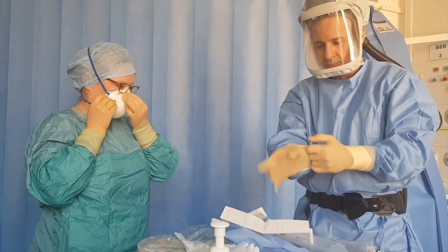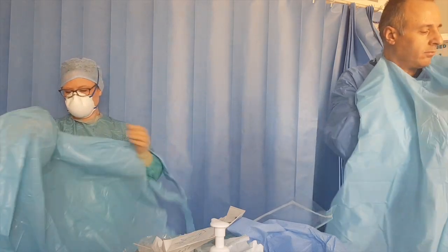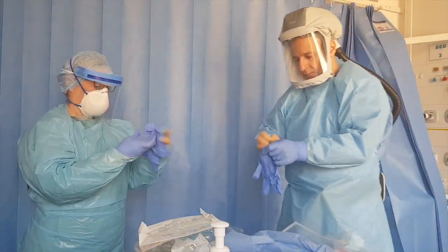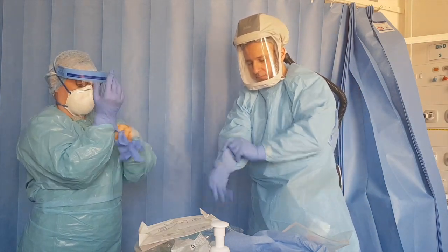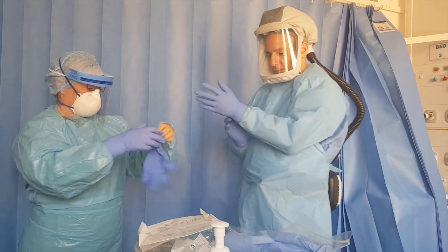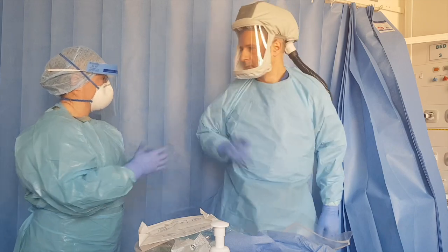after admission to ITU. Now, the second gown and non-sterile gloves. This second set allows for doffing of heavily contaminated PPE before transfer to ITU without the need to re-don additional PPE. Use a buddy system to check each other's PPE.